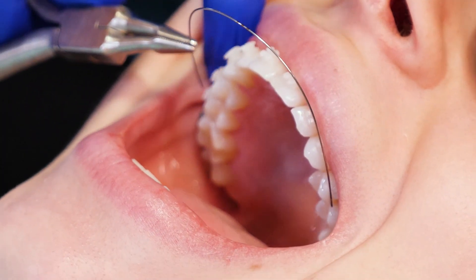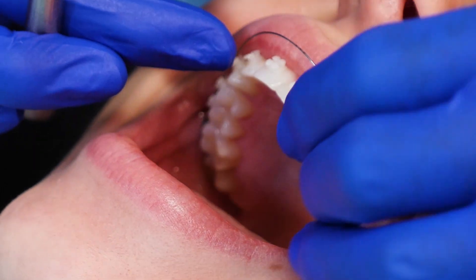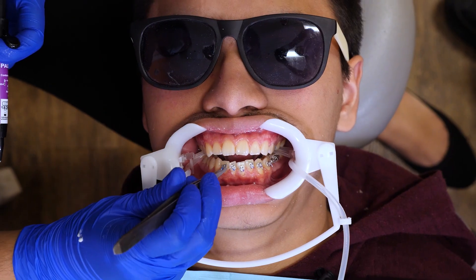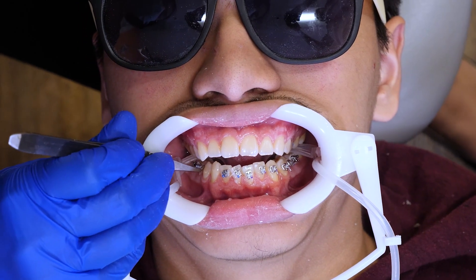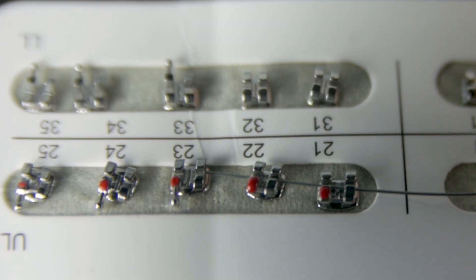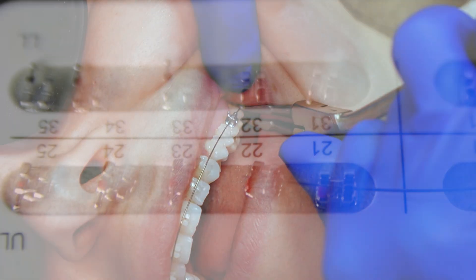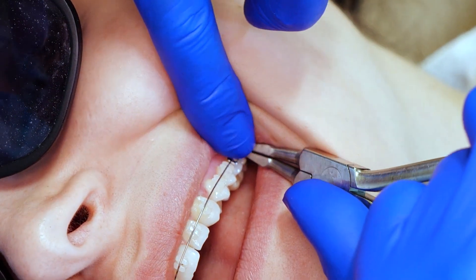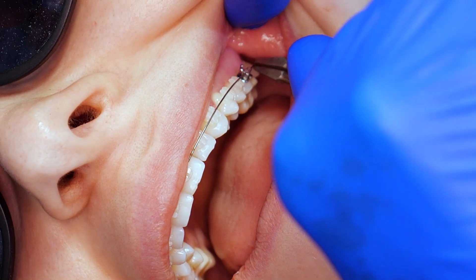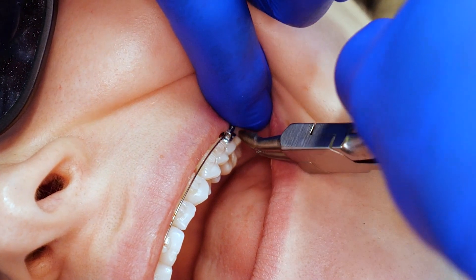Moreover, NiTi wires are highly flexible, allowing for easy placement within the orthodontic brackets and reducing patient discomfort. This flexibility also makes them suitable for early stage treatment when more significant tooth movement is required. In addition, NiTi wires have a low coefficient of friction, meaning they generate less resistance as your orthodontic assistant positions them through your brackets. This lower frictional force minimizes the potential for discomfort, making NiTi wires an excellent choice for orthodontic treatment.